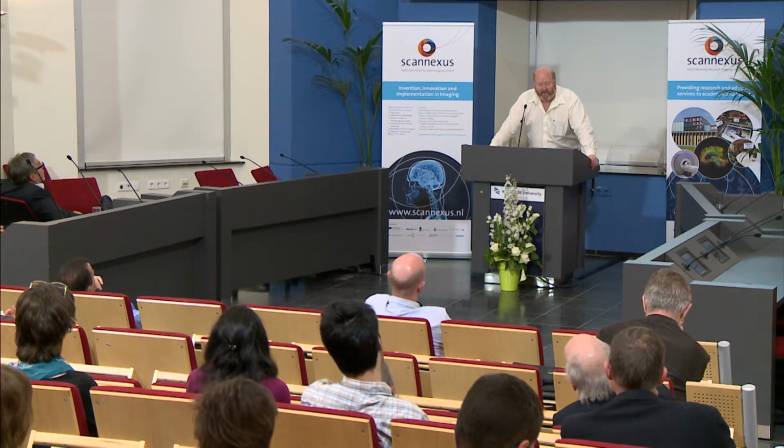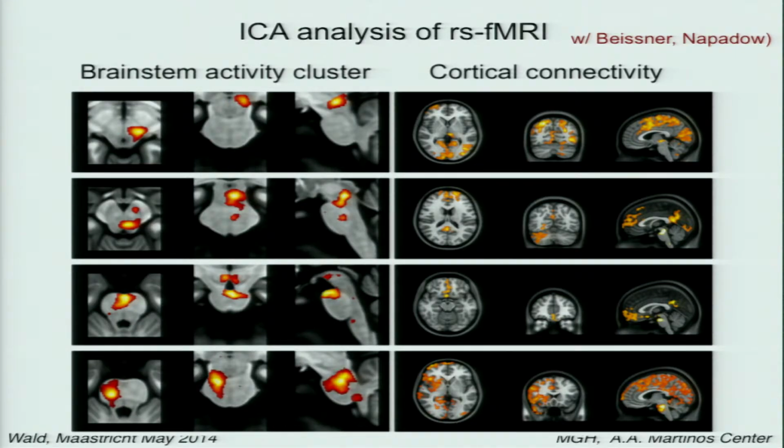Once you see the resting state patterns in the brainstem, you of course want to know where they connect in the cortex, so you simply use them and see where they connect. Here things get a little bit tougher because in a lot of cases nobody really knows where they should connect in the cortex. In some, like the lateral geniculate nucleus, it projects onto the visual cortex like you'd expect. LGN's not really brainstem, but it's down there and shows up in the ICA. Anyway, this is another cluster of them. So I think it's a really interesting field of study down there.